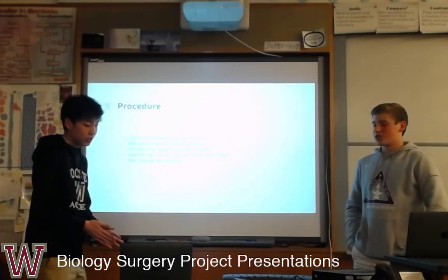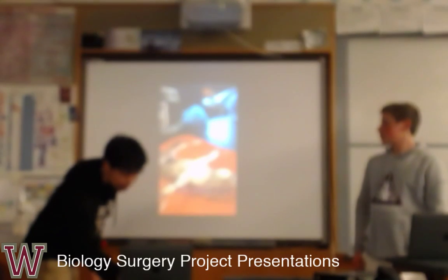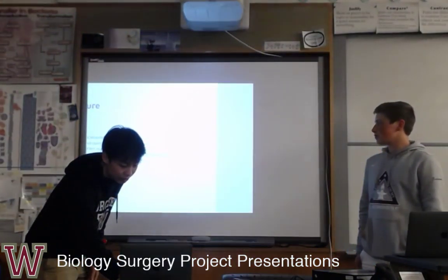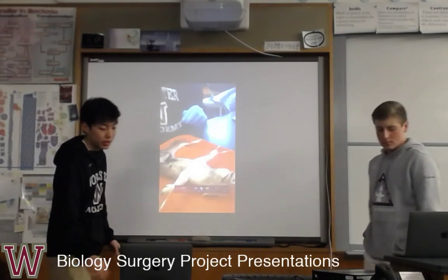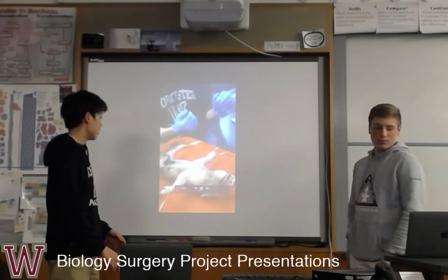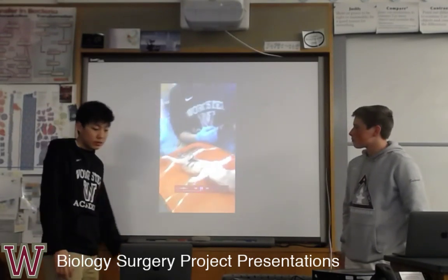For our procedure, the patient was strapped to a board so his belly would be exposed, and we cut open the belly to locate the appendix. This is a clip of us. As you can see, he was strapped down to expose his belly, and right now we're cutting it. Around there would be where the appendix is.